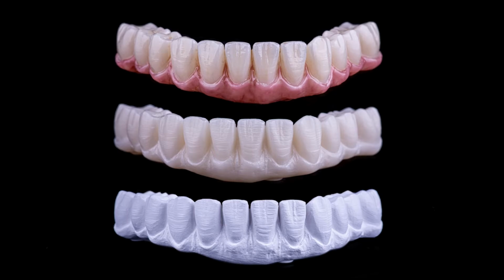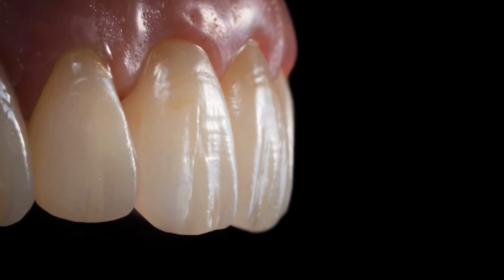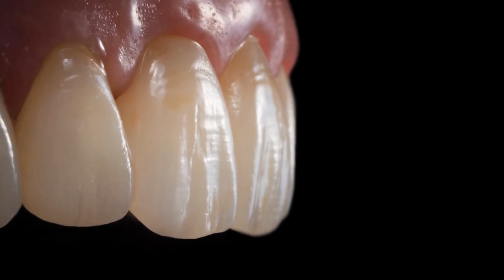What we do when we process like that is preserve all the data captured by our clinicians. Very true, Conrad. Layering ceramics can, in some cases, dilute the advantages of a digital workflow. So being able to process in a monolithic material not only reduces our dependency on arduous hand processing, but it also helps us deliver a more predictable final result.